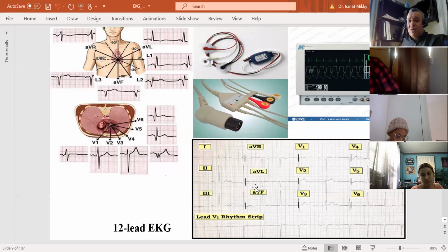Only one lead is going to run all the time, right, Khadija? Can you just attest to what I'm saying? So we have only one lead. Do you use lead 2? At my first hospital, yeah, we use lead 2, but it depends because some have 6 leads, some have 5, some have 3. It depends on what the doctor wants. Good. All right, thank you.